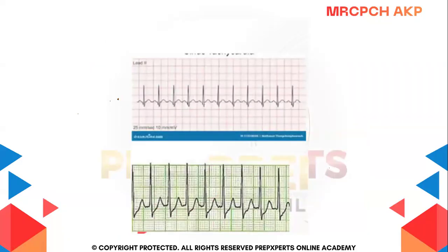Okay, so do you want to participate? Can any of you calculate the heart rate for me and tell me about the rhythm? Dr. Hafiza, are you there? Or anyone? Dr. Saira? Okay, you can type in the chat box if you want.